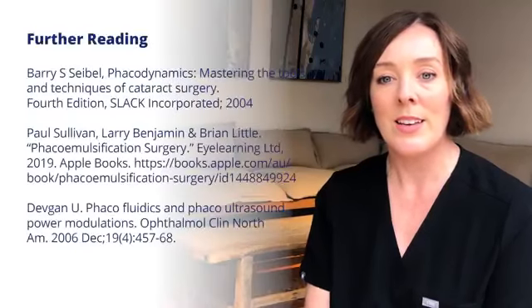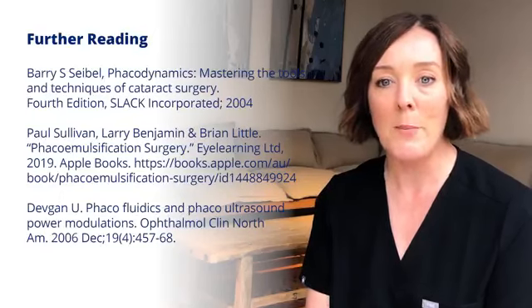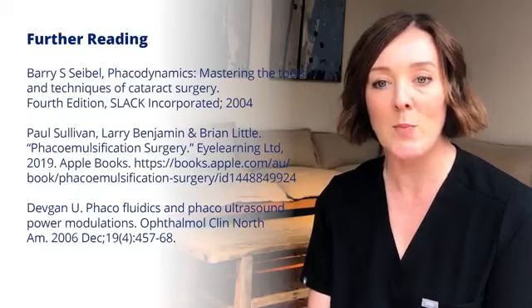I would suggest meeting with your company representative to create your own personalised settings for the machine that you use, and to make sure that you know when, why, and how to adjust those presets when necessary. In addition to discussing Phacodynamics with your students, mentors, colleagues, and company representative, I would recommend that you choose and read at least one reference text. I've found those listed here to be quite useful, although do bear in mind that this technology is changing super quickly. It's so exciting and quite hard to keep up.